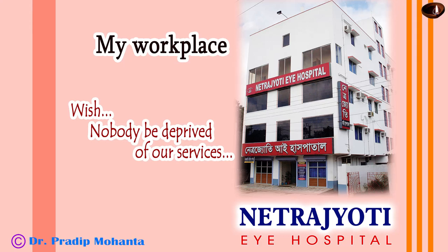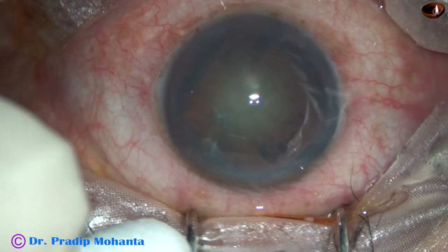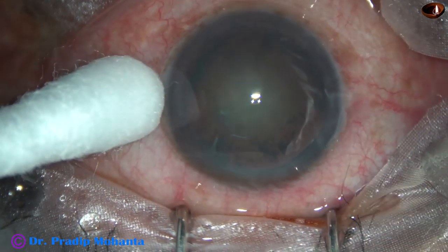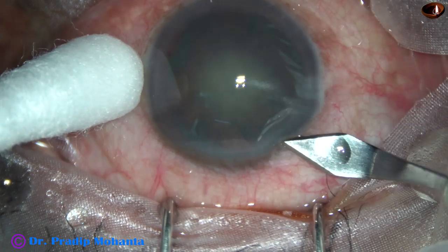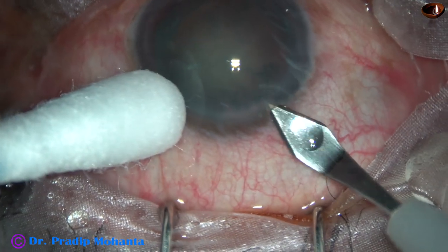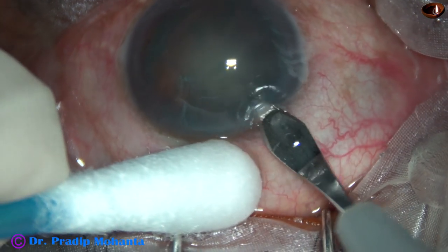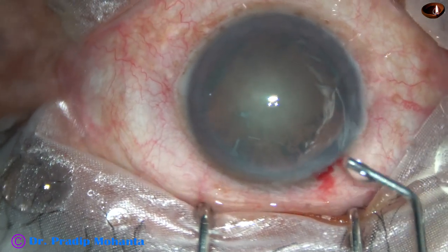Friends, welcome to Gurgaon, the millennium city of India. In this video, I want to demonstrate direct chop in a routine case. No big deal — just divide the nucleus into pieces by direct chop. No trenching, just hold the nucleus with vacuum and chop it into fragments.